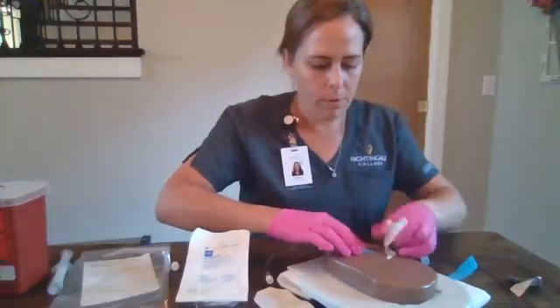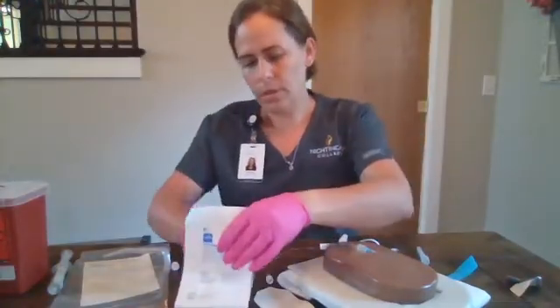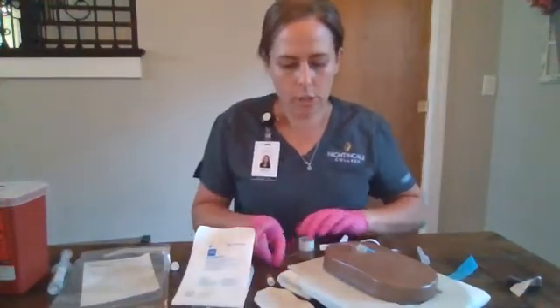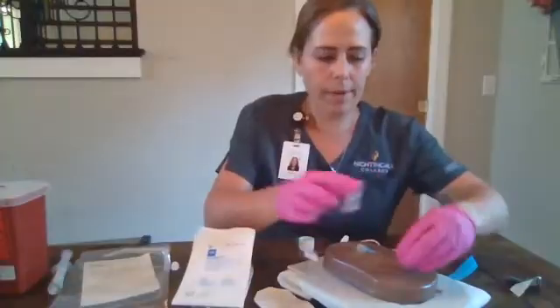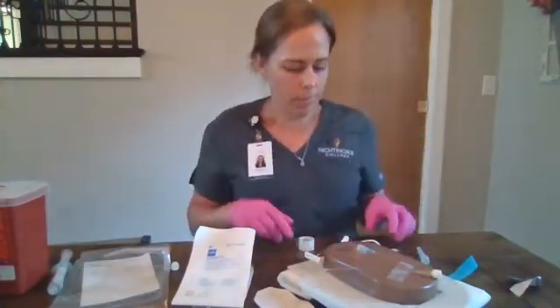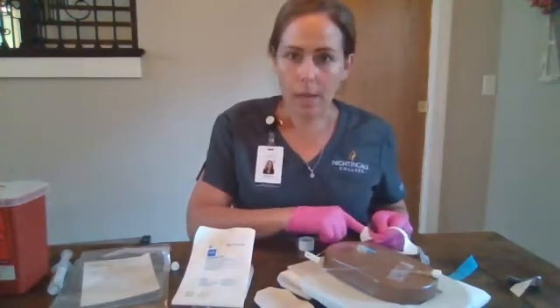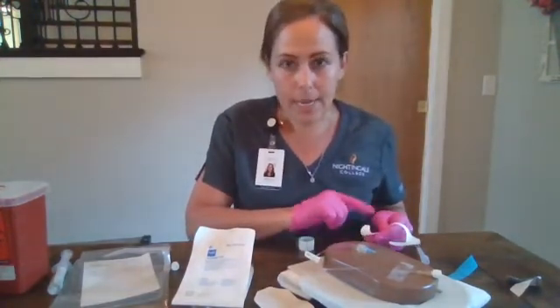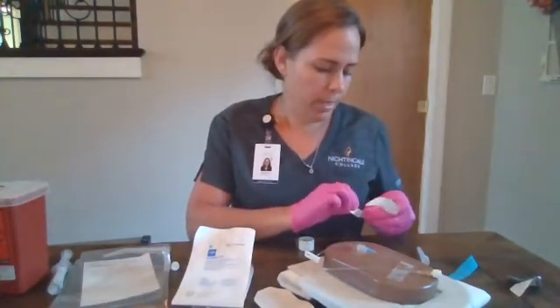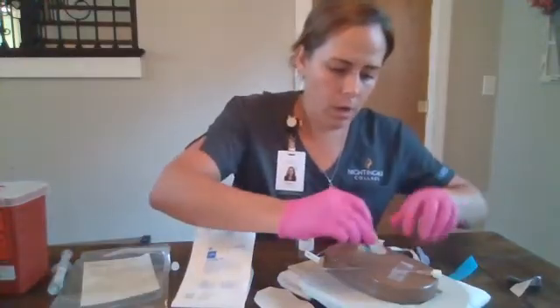We will remove that wrapper. We will tape down our extension tubing, loop it up and around and tape it, ensuring that it doesn't get taped over the tegaderm. Then we're going to label our dressing — we're going to place the date, the time, the gauge, the length, and our initials, and we will place that on our dressing.